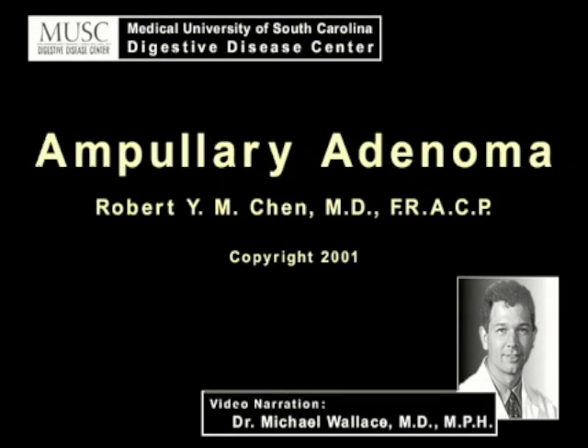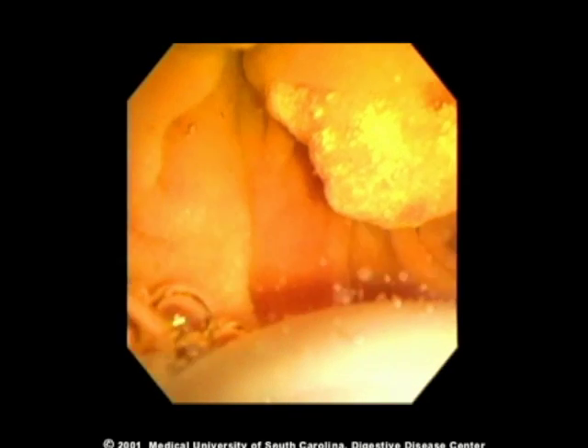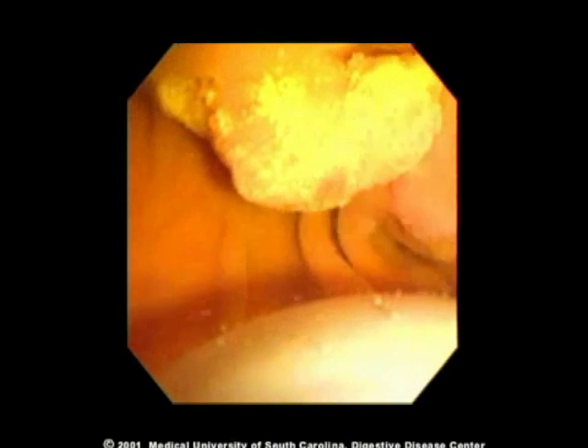This case demonstrates the technique for imaging an ampullary adenoma. The transducer is placed immediately across from the ampulla and the duodenum filled with water. A paralytic agent such as glucagon is administered to minimize motility of the duodenal wall.